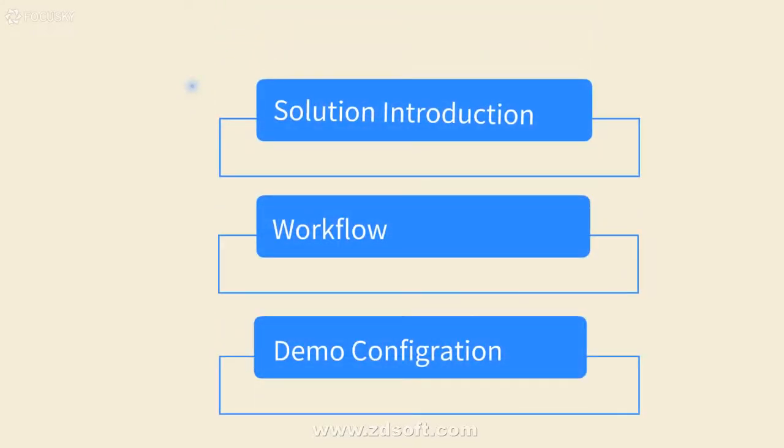Welcome to Eden's Patient Monitor Solution. Here we will go over solution introduction, workflow, and demo configuration.